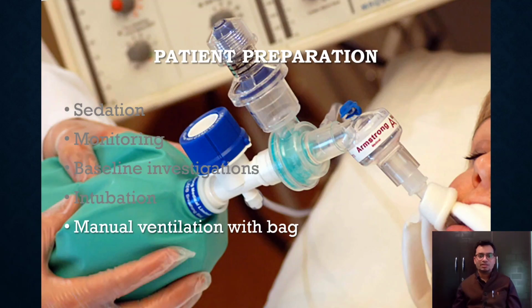After tracheal intubation is done, connect the tube with an ambu bag and push in 4 to 5 puffs of air while auscultating the chest. This will give you the tactile assessment of lung mechanics in your hands, whether it is difficult or hard to ventilate or whether it is very easy to ventilate. You will find out. Bronchospasm and poorly compliant lungs will be difficult to ventilate, obviously.